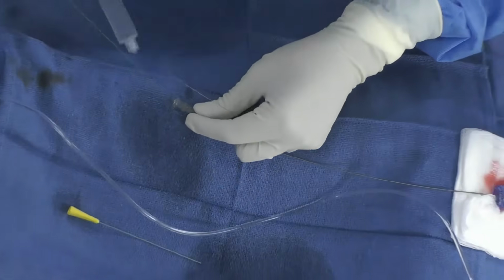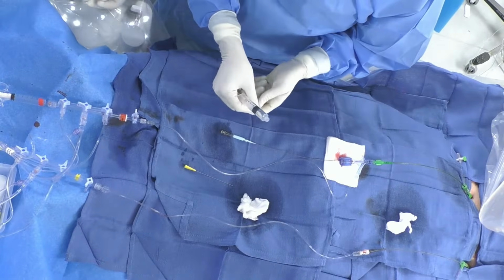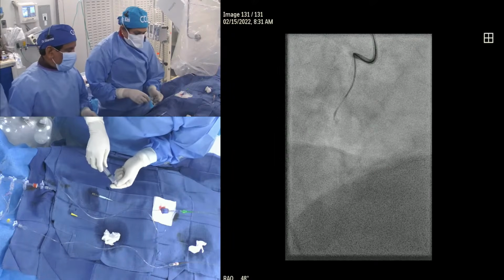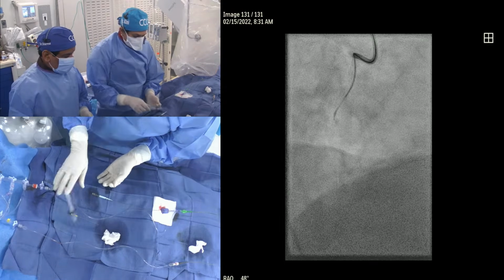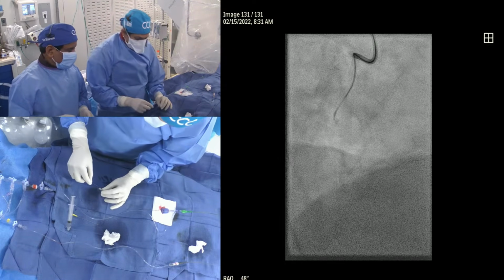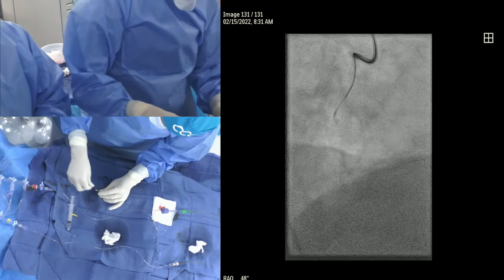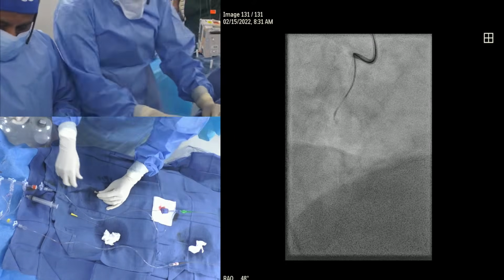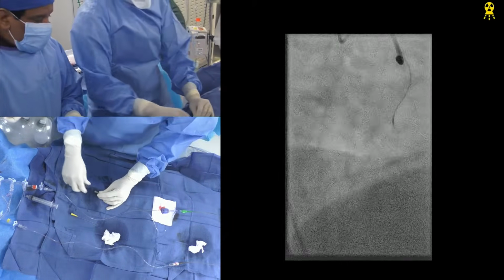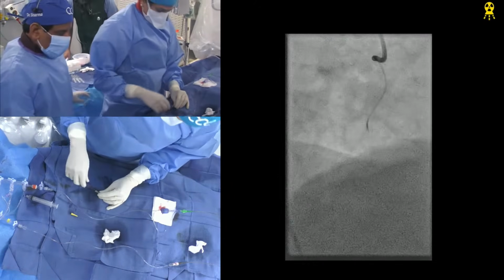Okay. So, Anu, have you had times when you modified the tip of the Gaia? Yeah, when we modify the tip, it loses something. It's not that easy, very difficult to introduce into the microcatheter. Maybe use a little needle there to do that. But exactly right. So this would be wire number 3. Yeah. Okay.